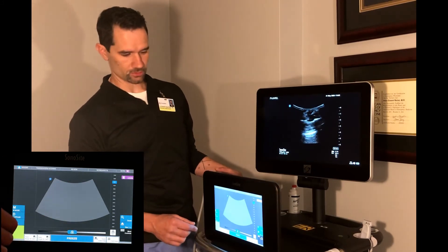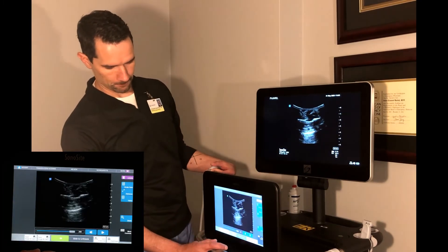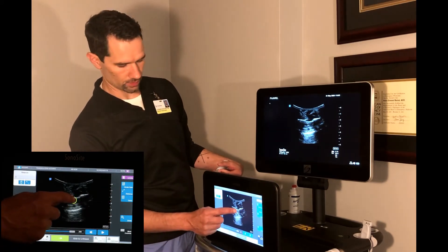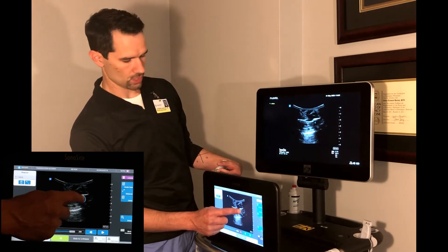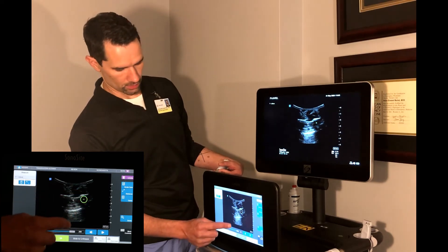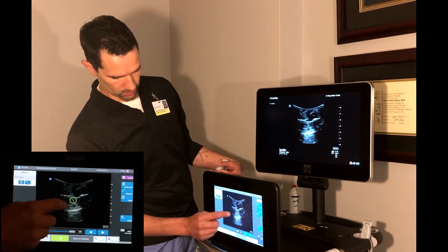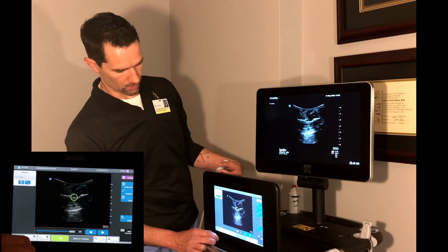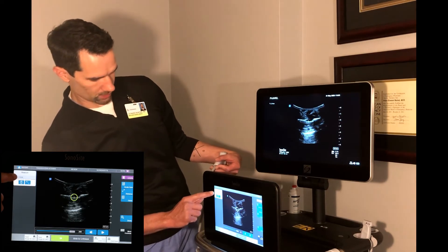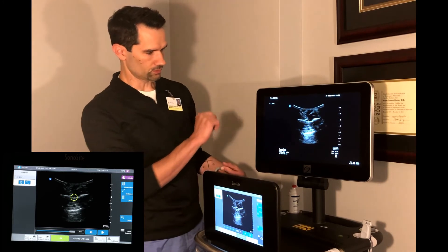Those are the basic adjustments for the ultrasound image. If you want to take measurements, hit the freeze key. On the right-hand side, select the distance tool — that'll bring up a circle. As you move one of the calipers with your finger on the touch screen, it'll give you a distance. Select the other caliper and bring it over to measure between two points. The measurement is displayed both in the upper left-hand corner and on the screen itself.